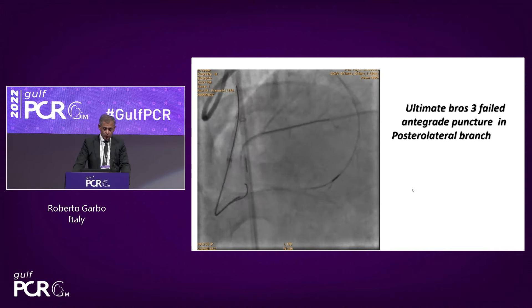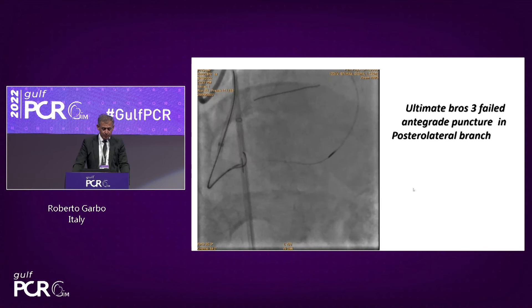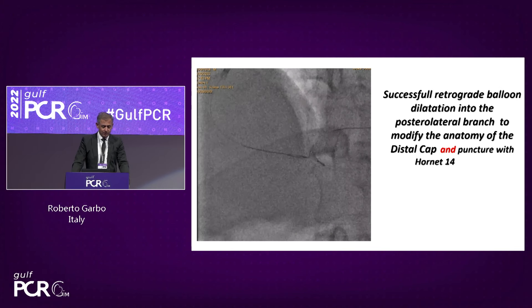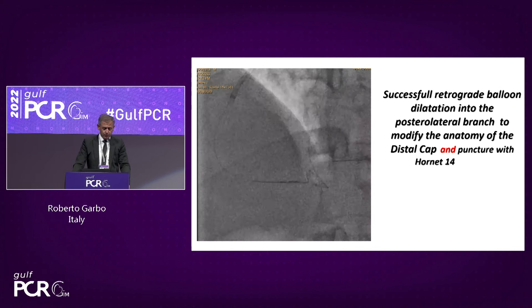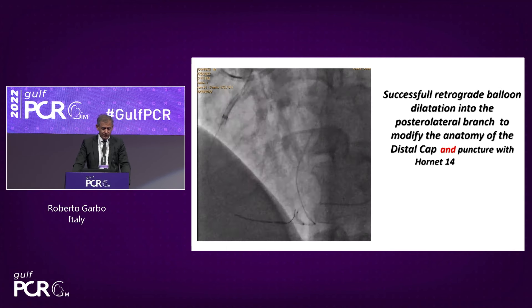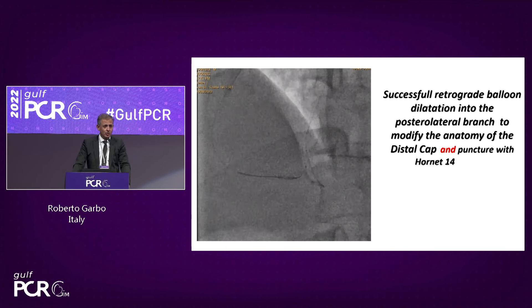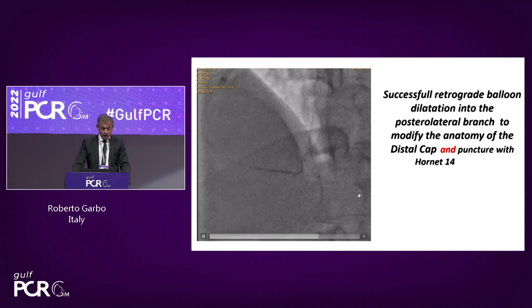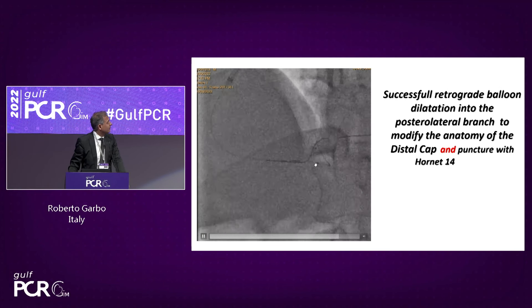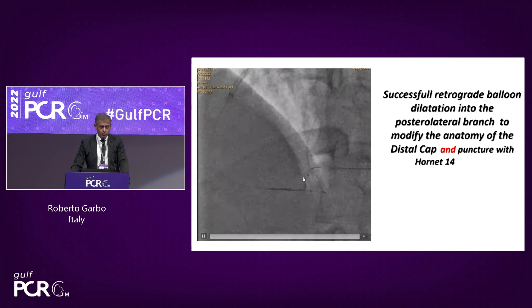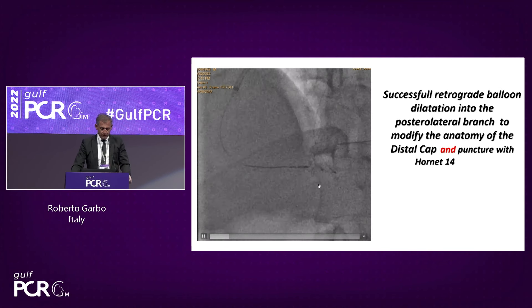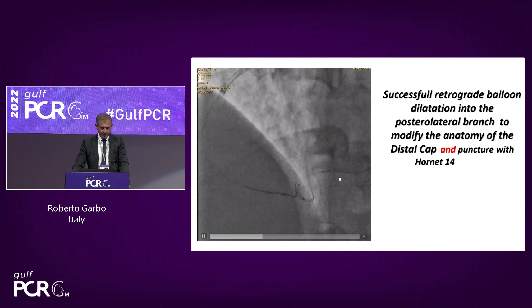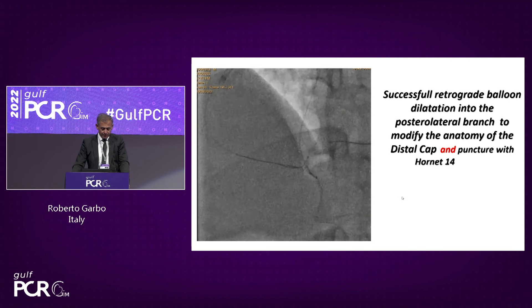I removed the microcatheter from retrograde and took a balloon — a sort of CART technique: balloon dilatation from the septal going retrograde to modify the distal cap at the level of the bifurcation, helping antegrade wire penetration. The Hornet wire was able to puncture, as you can see, but I had a fracture of the wire tip due to the heavy calcification at the bifurcation and the complex anatomy.